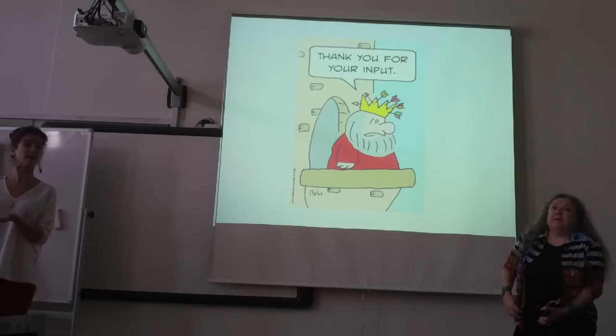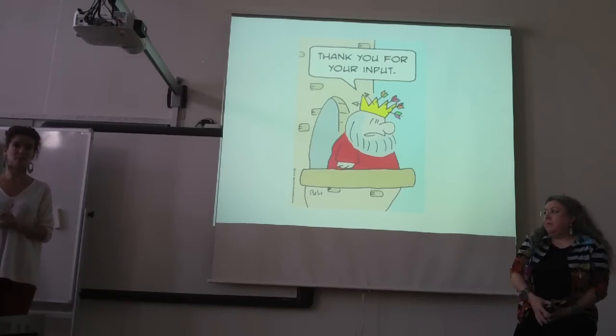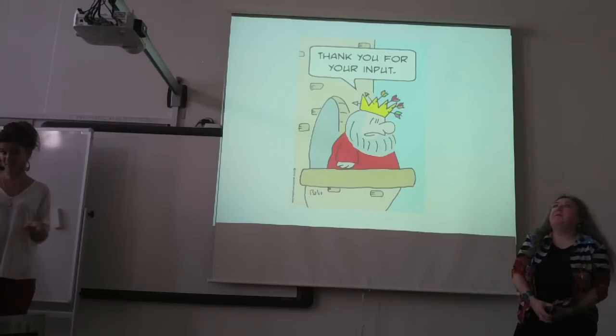So we also went higher than the top C, and also with this one that we also think could be flageolet, but still I'm with one gazillion question marks, like what is flageolet? So we all went for, we believe now that this is flageolet. But that was personal, every singer had their own idea of what they thought it was.